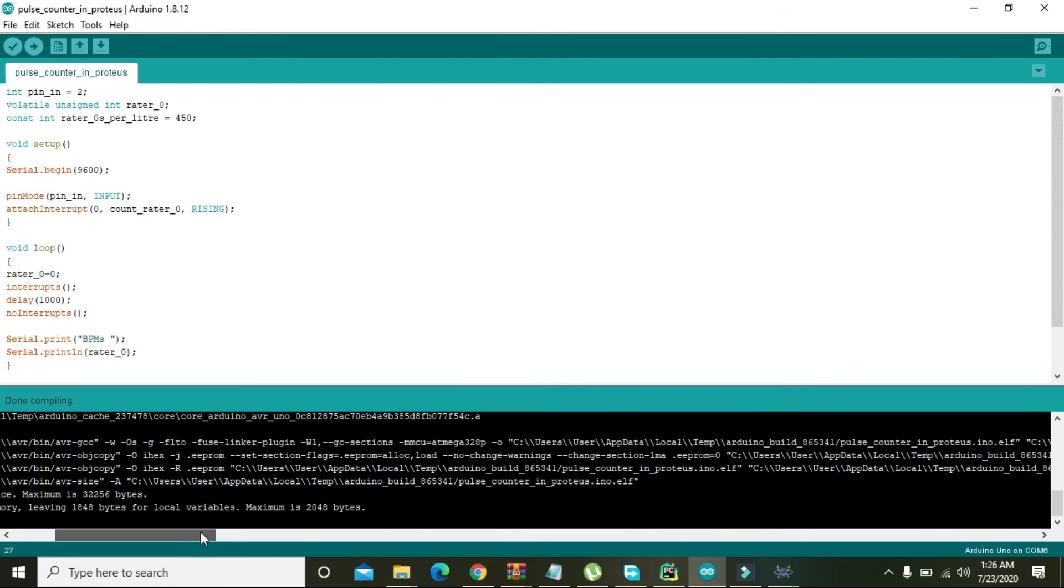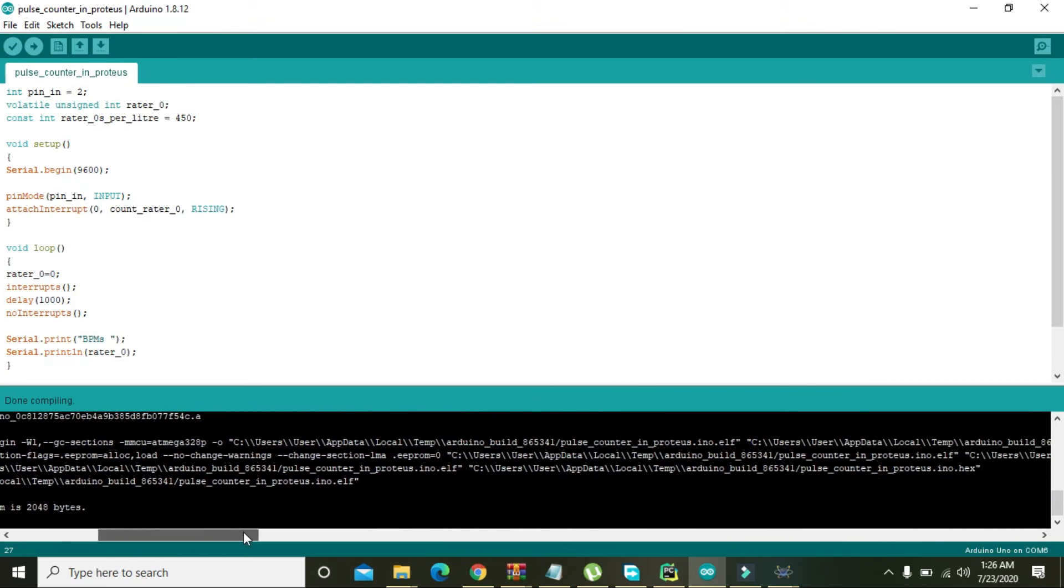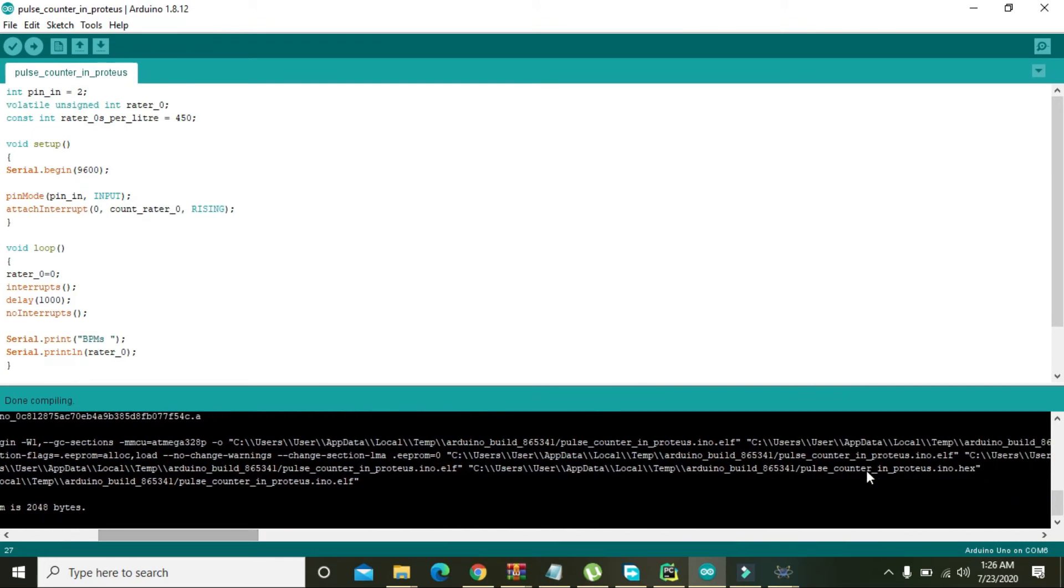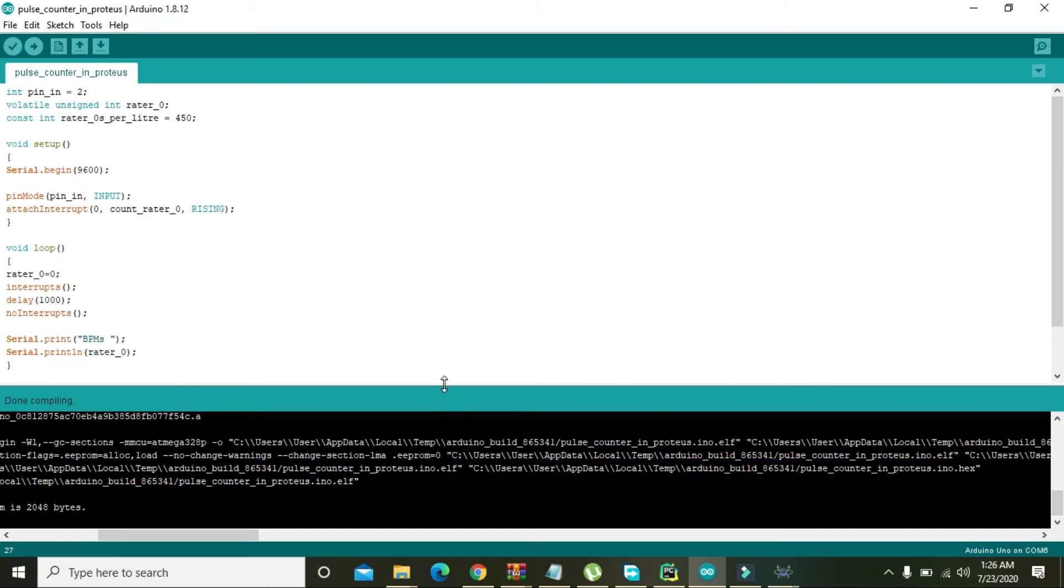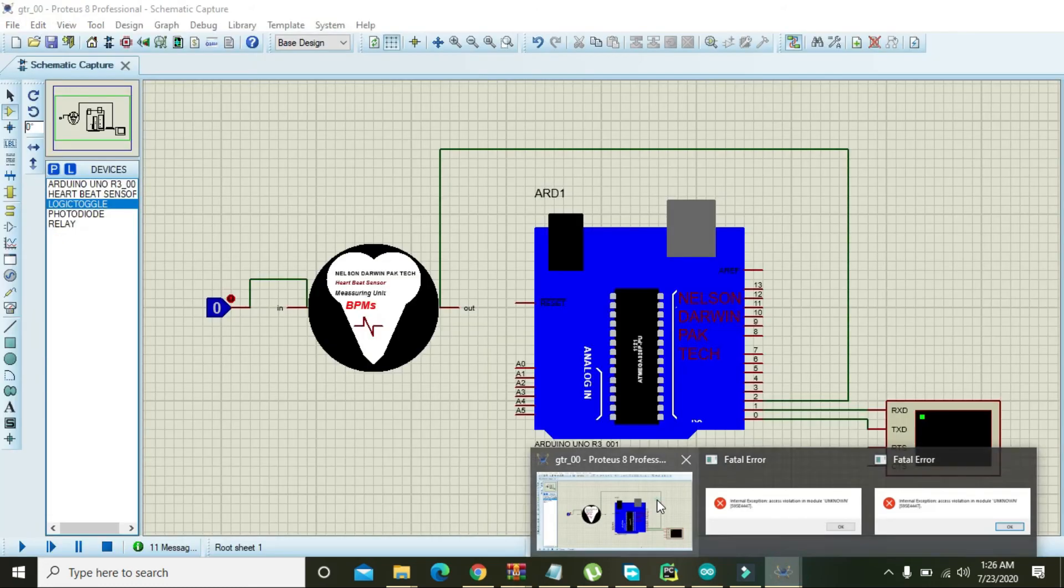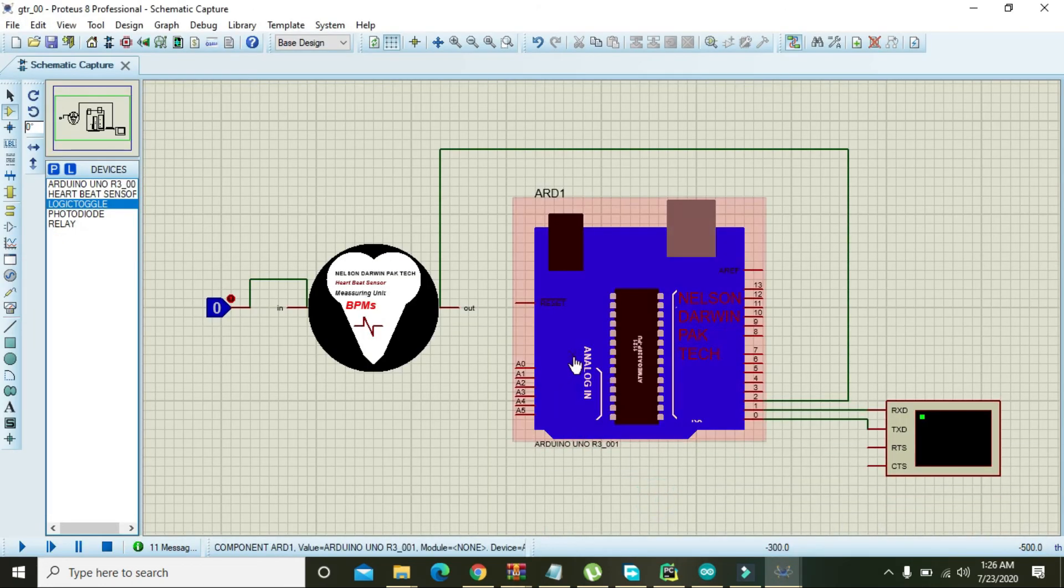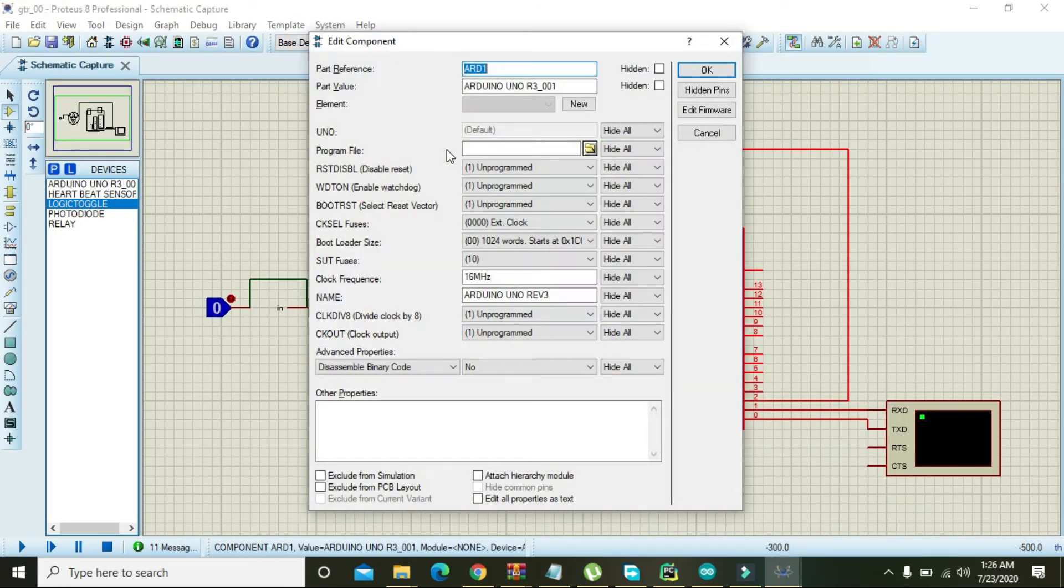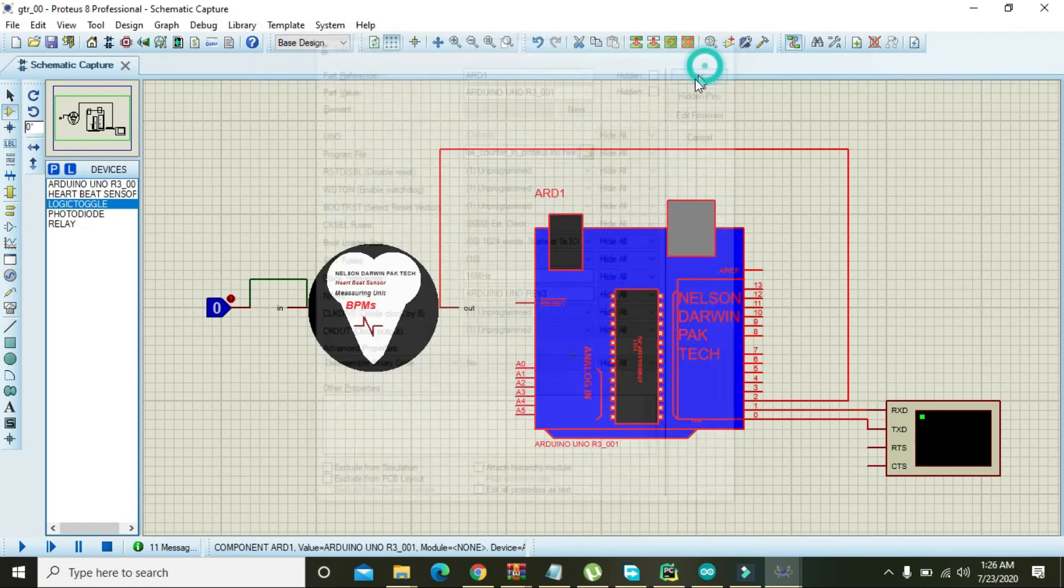And now you can see that you have this link that is ino.hex. Control C, copy it and go to the Proteus, and double click on the Arduino and just paste it here, press OK.